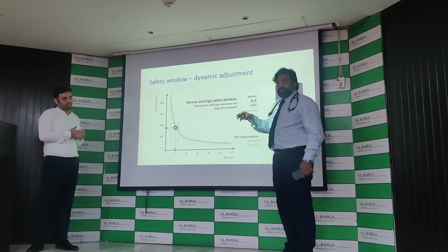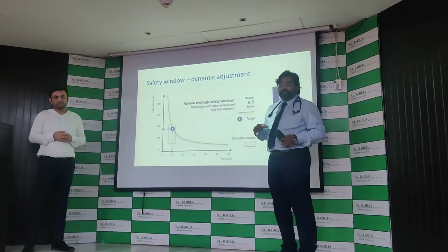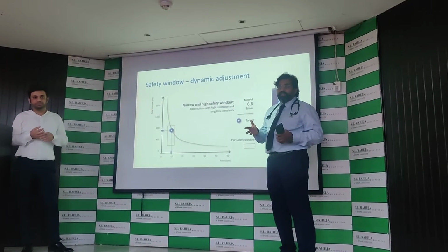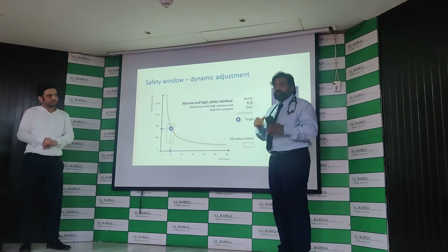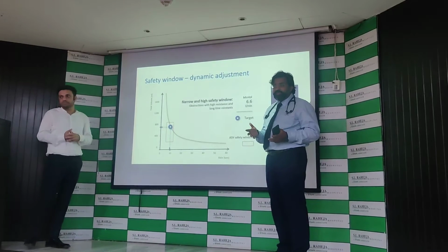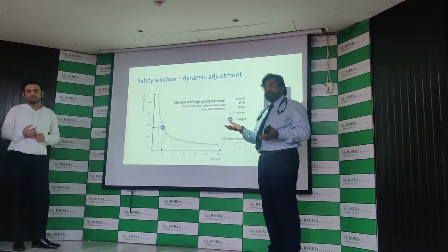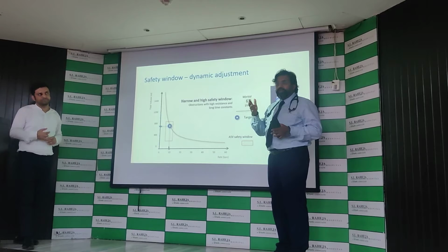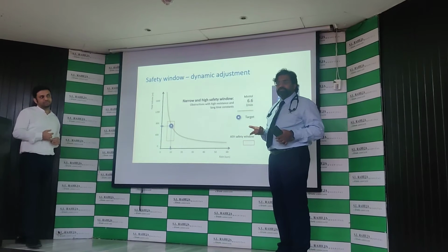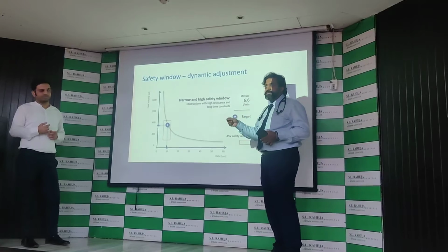So if the compliance has suddenly gone down, what does it mean? It means that the lung volumes have gone down. The time constants will change here. At that moment it will figure out that this is not safe for this patient because compliance has changed, if there is a barotrauma or a volutrauma. Again, for obstructive it will change as per what your compliance is. If your resistance or compliance changes, your box will change. You understand? It is trying to figure out that box based on your compliance and resistance.